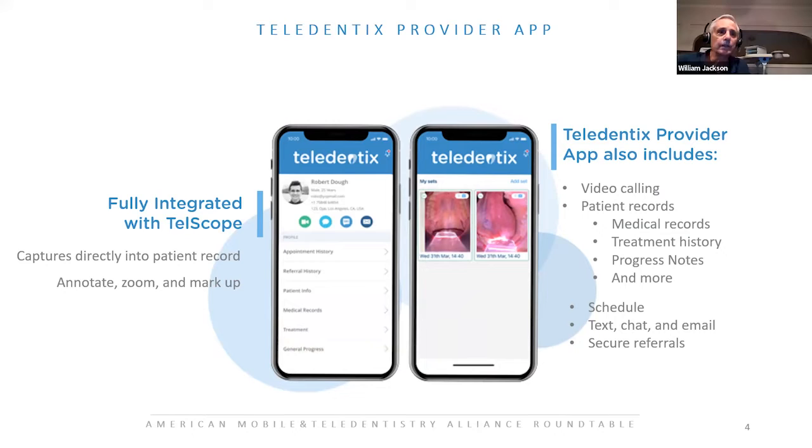Yeah, thanks. And good evening, everybody. So we're, by the way, really excited to work with Holland Healthcare, having met Jennifer, heard her vision, and what we've seen as we've been working with Holland is that we now have something that kind of completes the circle.